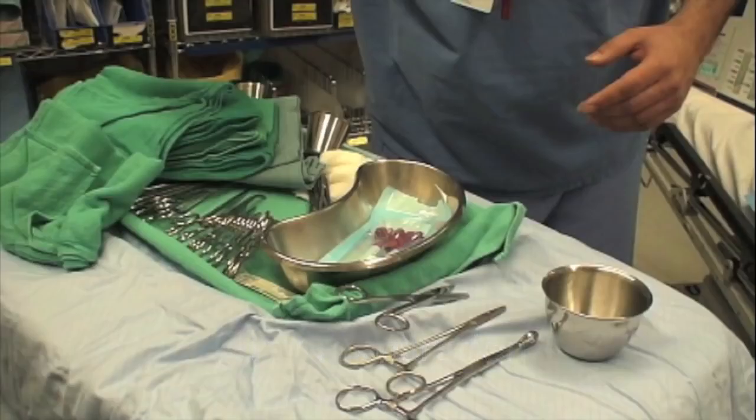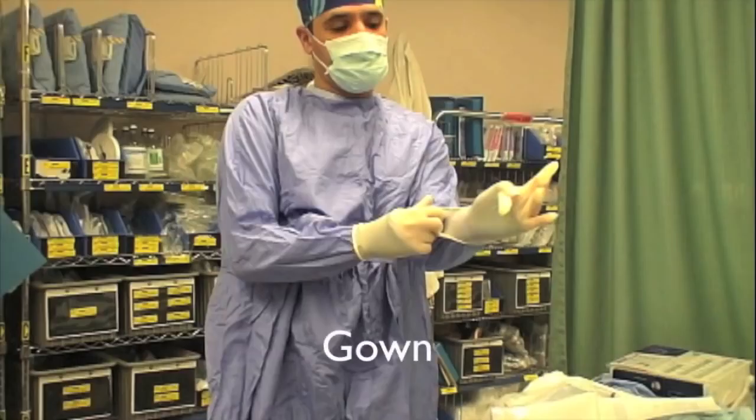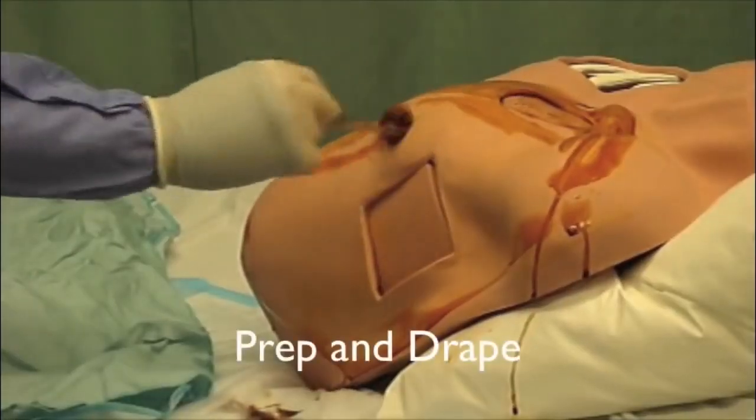Open the tray, set aside sponge forceps, needle driver, and scissors. Prepare local anesthetic, povidone solution, scalpel, FlexiTrack, and suture. Don mask, gown, and gloves.